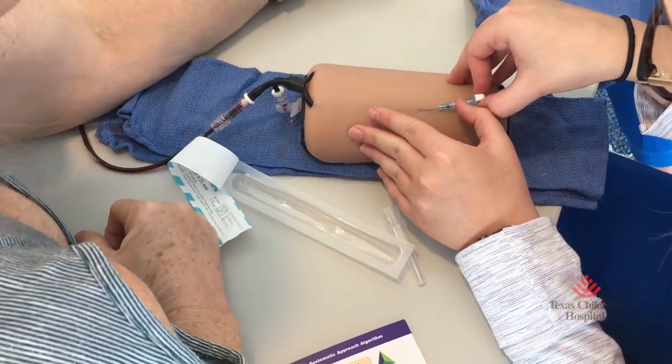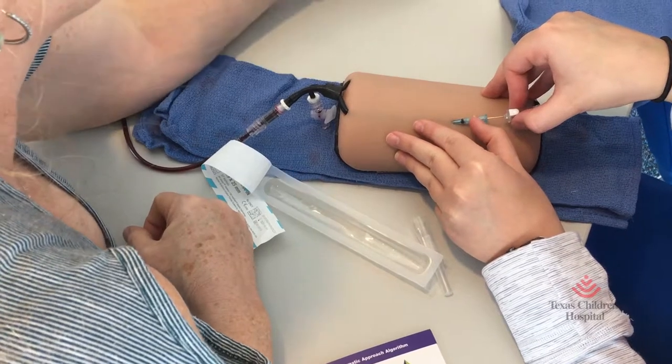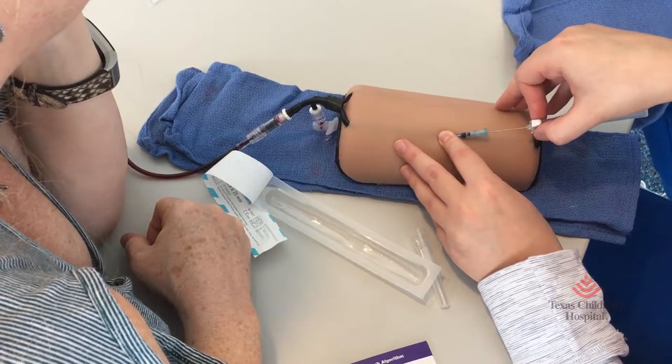Don't go in with your needle — leave your needle where it is. Same thing. You want to go up at a little bit more of an angle. Go ahead and slide it on in all the way to the hub. Use your other hand to stabilize your patient. Go in at a little higher angle. There you go.